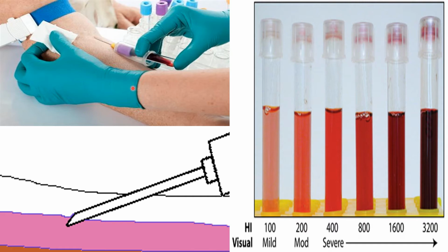If it's a traumatic venipuncture, there is a possibility for the introduction of the tissue juice into your sample, or it could promote clot formation. And then we have here a picture of tubes showing you a hemolyzed specimen. Again, a hemolyzed specimen is an unacceptable specimen for coagulation testing.